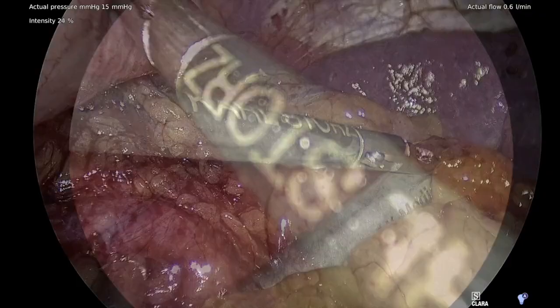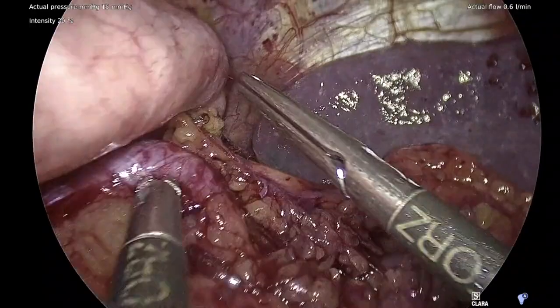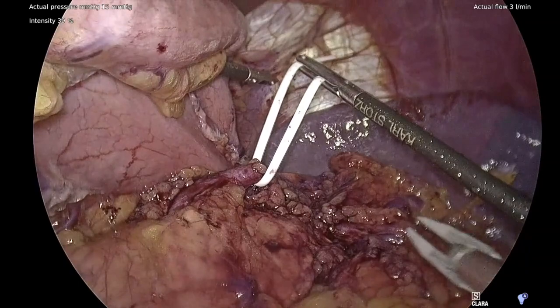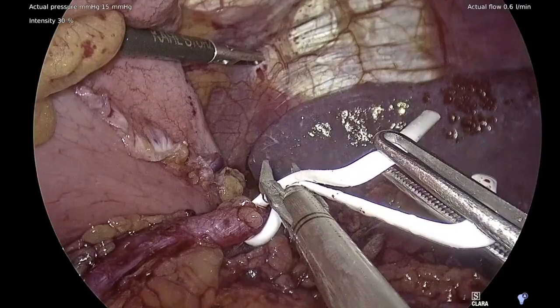Next, we obtained proximal control of the splenic artery by dissecting posteriorly to the artery and encircling the vessel with a vessel loop secured with an endoclip. This allows for a convenient handle to further facilitate dissection of the vessels. In addition, in the case of bleeding, this allows for good proximal control of the artery.